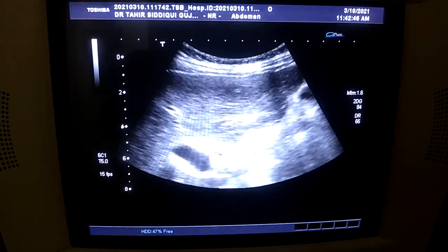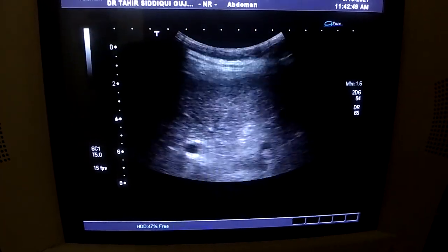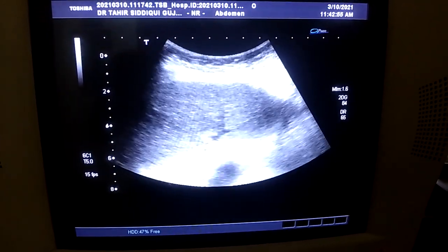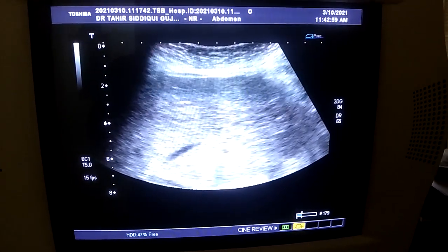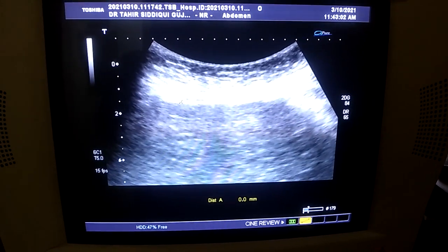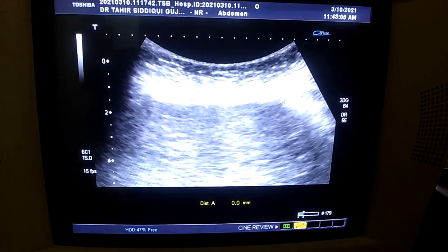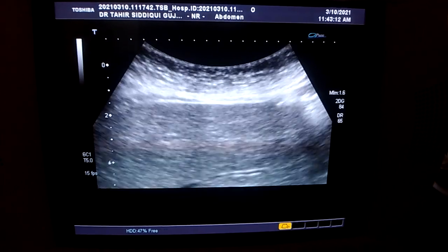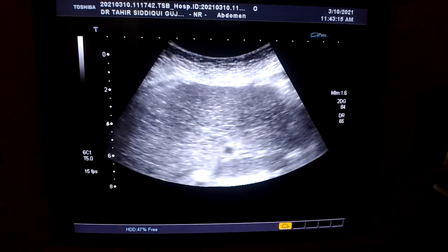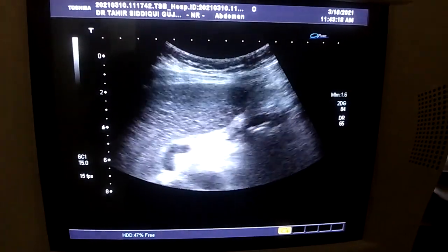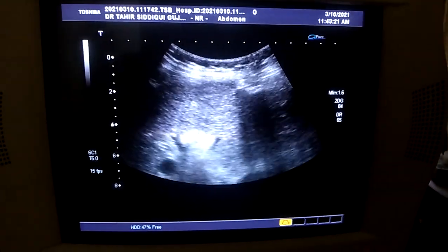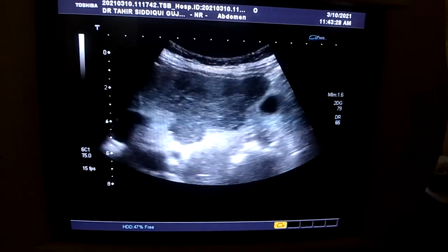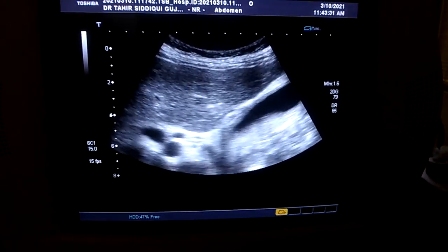However, the liver is showing chronic liver disease. You can see that the outer margin of the liver is irregular — this is the outer margin of the liver, it is irregular. Its texture is coarse and echogenic. This is the cirrhotic liver, and that is the reason we have seen the gallbladder wall thick because of adjacent liver parenchymal changes, or we can see this liver in a very initial stage of ascites. So the gallbladder is okay.